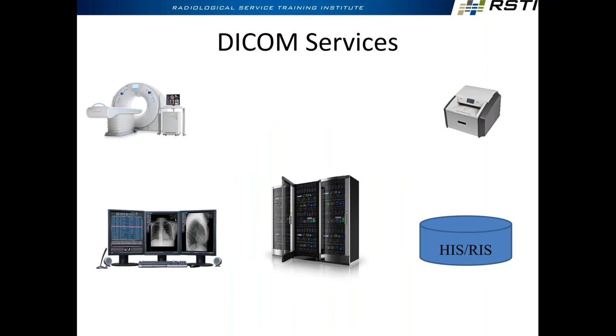We are now up to slide 11, page 6. This is more of a graphical summary of what we just talked about. When talking about DICOM store, we're talking about sending an image. So it makes sense that these two devices are the providers, right? Why would the workstation need to be a provider? I thought a minute ago, I just said the workstation is a query retrieve user.